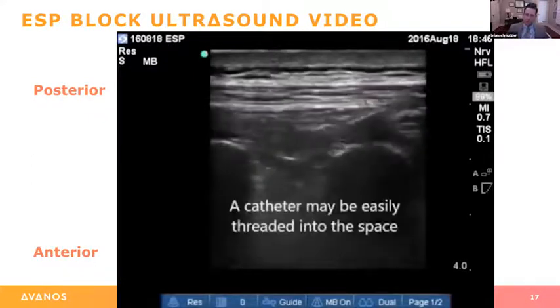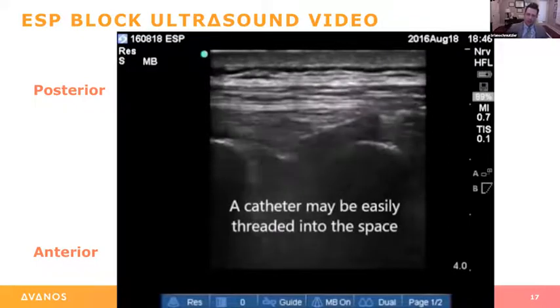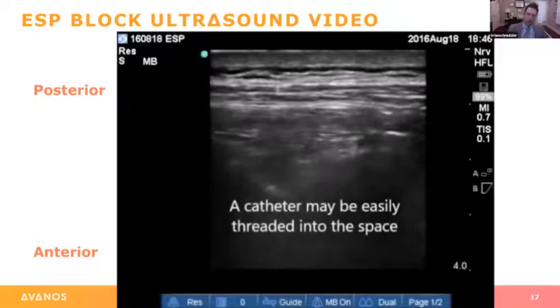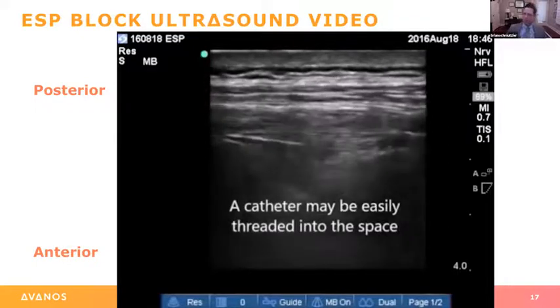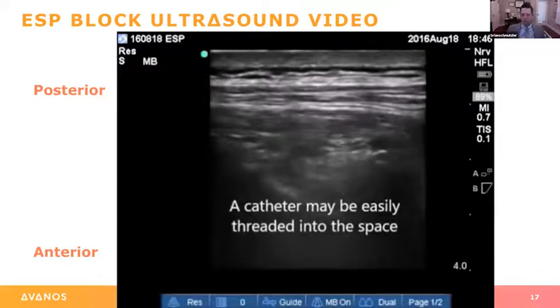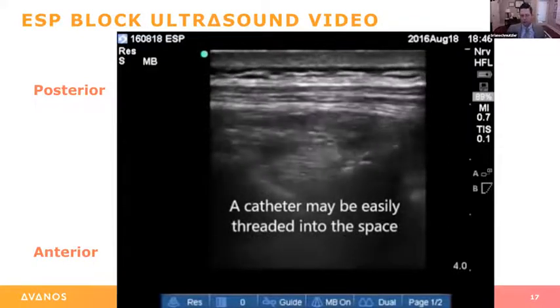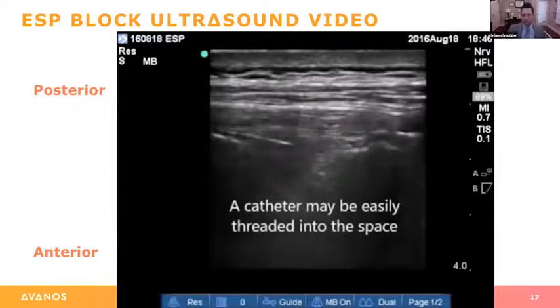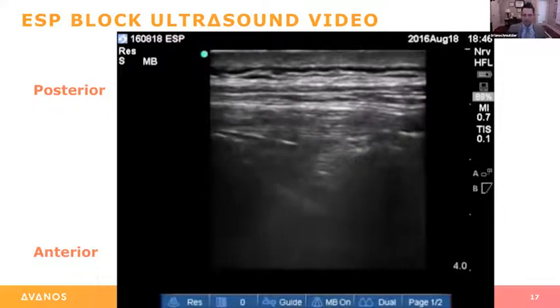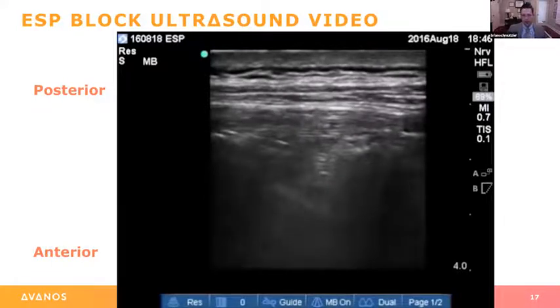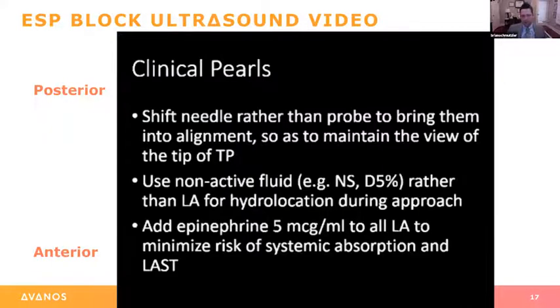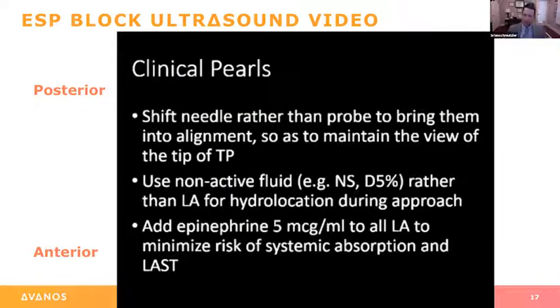This is one we did with the catheter through the needle. We almost exclusively use the catheter over needle now. On the left-hand side of the screen you'll see that catheter come through. Catheters thread really nicely through this plane — it's a nice big plane.